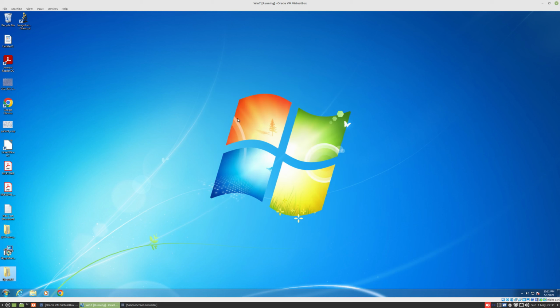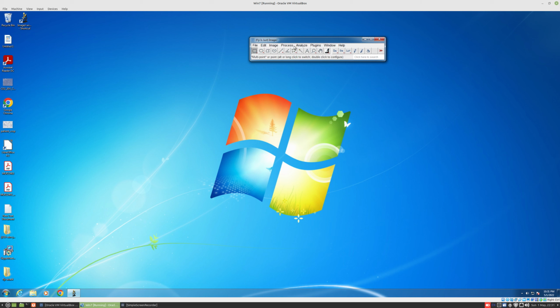Hi, this YouTube video is to explain how to use a script written for the software FIJI. I take for granted that you have already installed this FIJI software, which is an ImageJ software written in Java, which is available on Windows, Mac OS, and Linux.